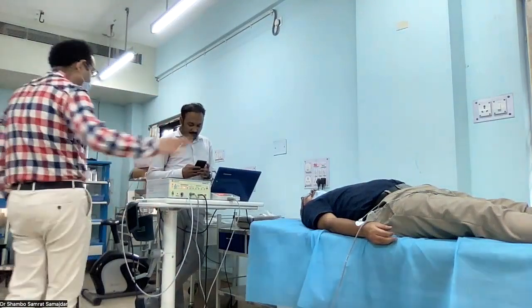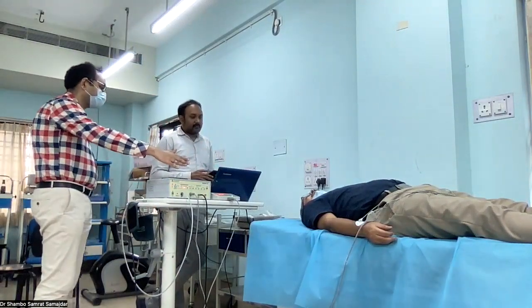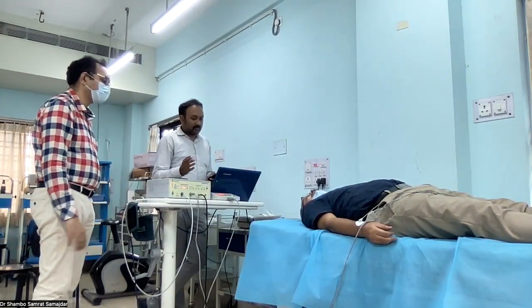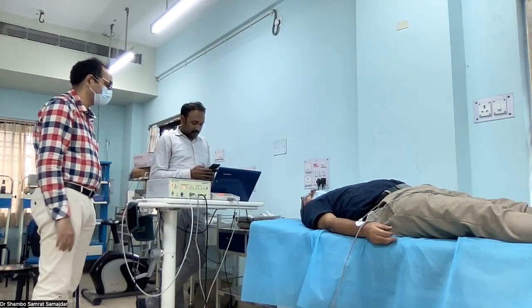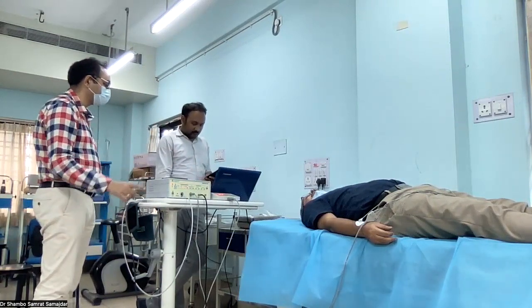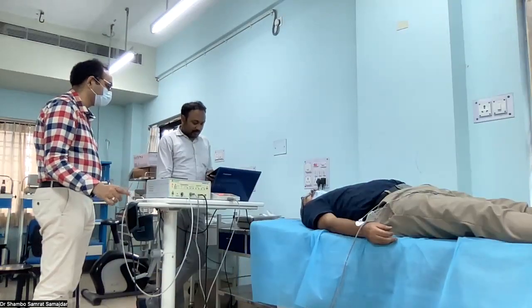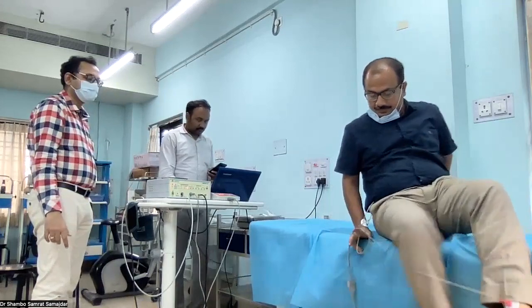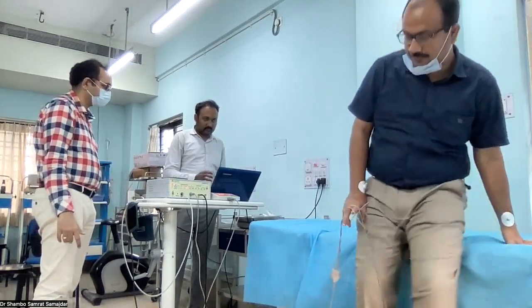Then we will ask, tell him that after some time we will say stand up, okay? Then immediately stand up. So you have to tell now, 1, 2, now stand up slowly. Now stand up. We need to ask them to stand up quickly.